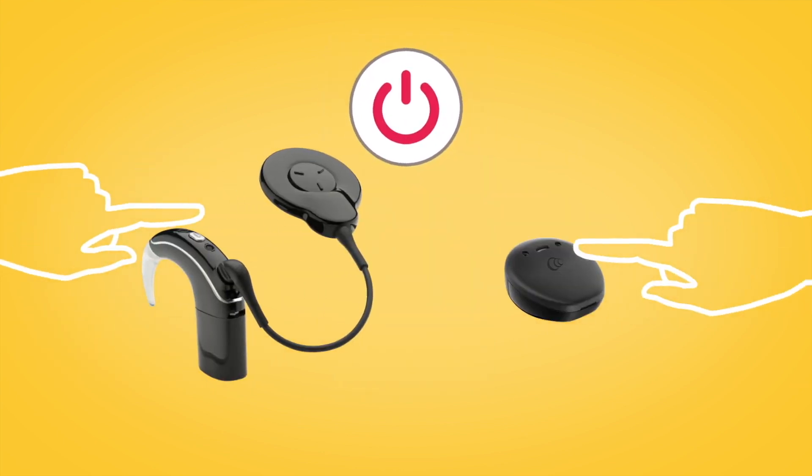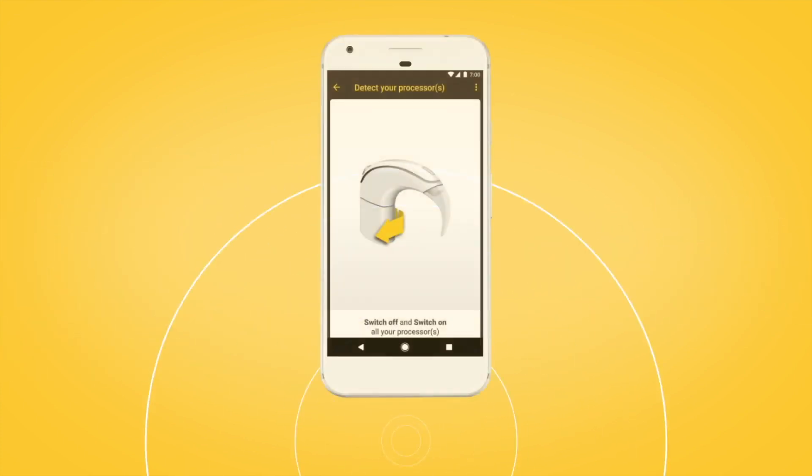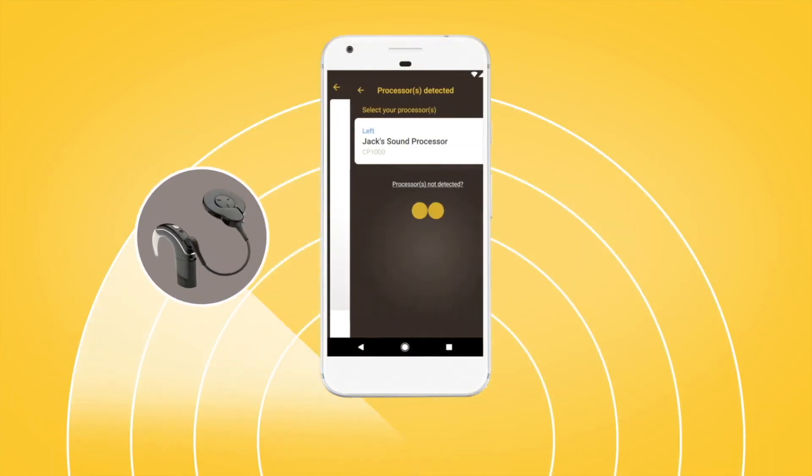Next, turn your sound processor off and back on again. Your Android device will then search for your sound processor and display it on your screen.